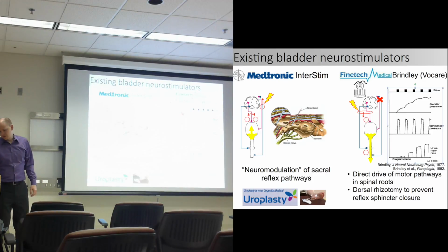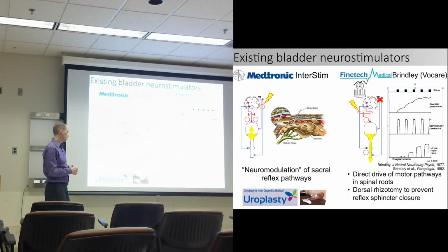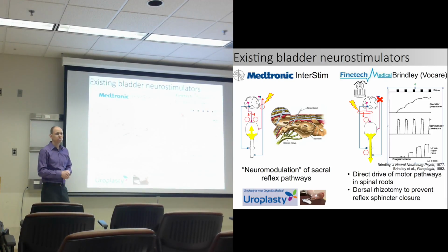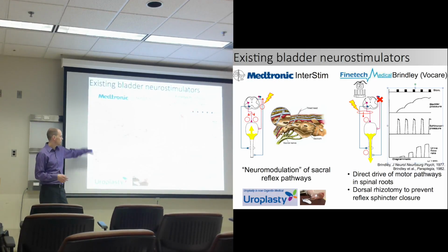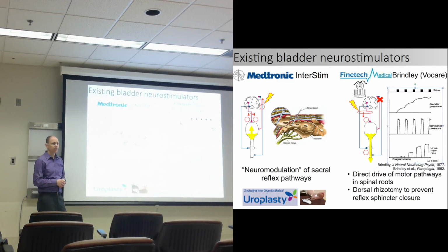And then recently, there's another device that's starting to pick up clinically. I've heard of it in urology, Urgent PC, a device in which posterior tibial nerve stimulation is performed, but basically an acupuncture needle is placed near the ankle, and individuals might come in for 20-minute sessions on a weekly basis. The same patient cohort is perhaps administered the device and seems to show improvement in bladder function.